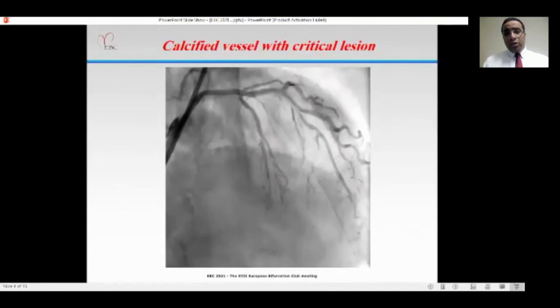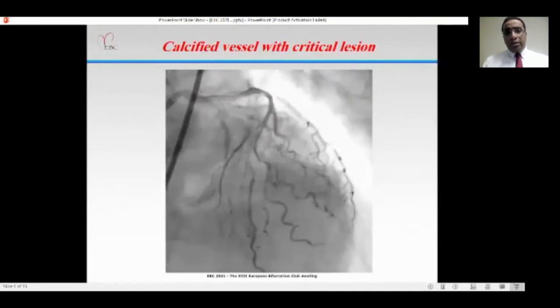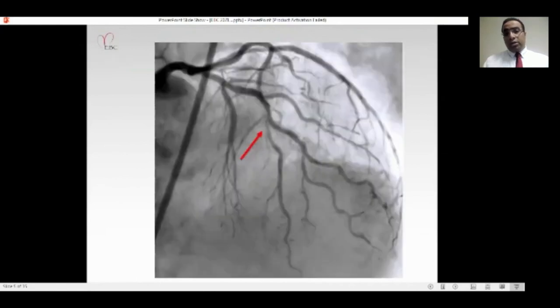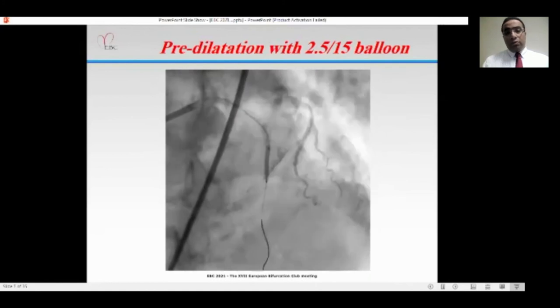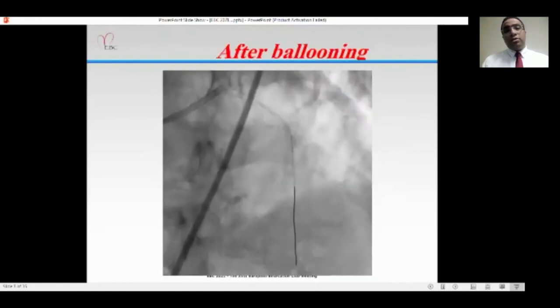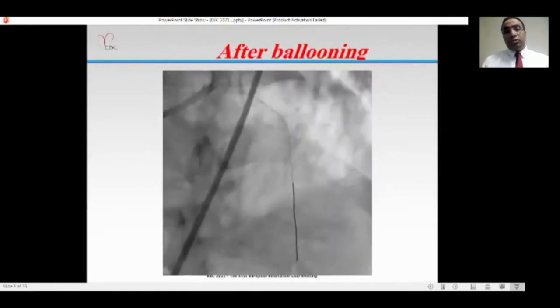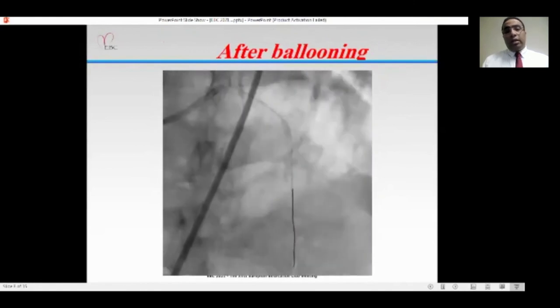This is the coronary angiography of the patient. Very tight stenosis at the level of the diagonal, a sizable diagonal branch. This is the tight stenosis. I decided to prepare the lesion using a 2.5 by 15 balloon, inflated at 12 atmospheres. And this was the surprise after inflation of the balloon: perforation of the coronary artery at the diagonal branch.